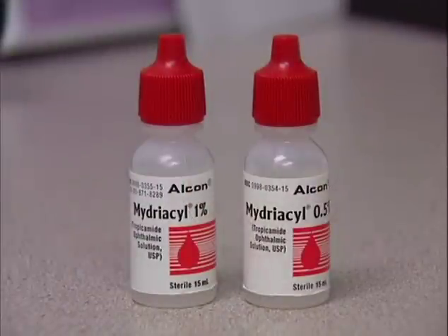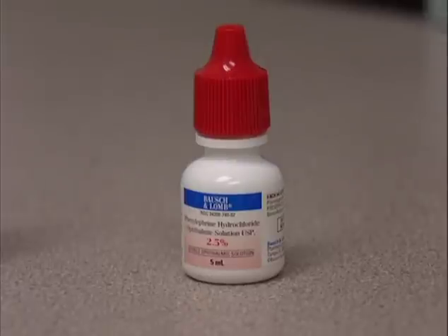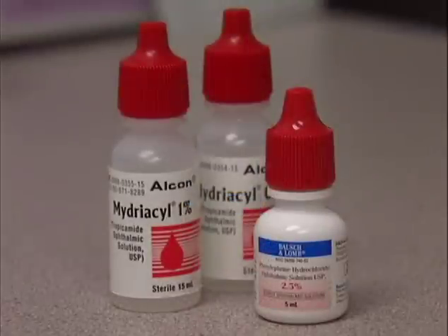The direct ophthalmoscope is used to assess the red reflex of the patient's fundus and to view the retina and optic nerve. This evaluation is best performed with the patient's pupil pharmacologically dilated. Although ophthalmoscopy is enhanced by dilation, it is possible to perform it without dilation. Two commonly used dilating agents are tropicamide, available in 0.5% or 1% concentration, and phenylephrine, available in a 2.5% concentration. Tropicamide is an anticholinergic agent, and phenylephrine is an adrenergic agent.